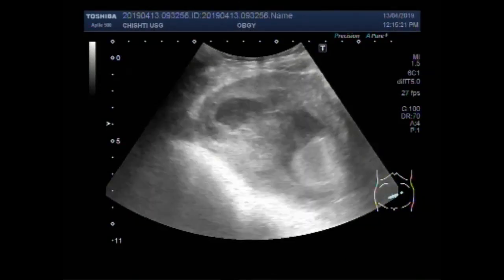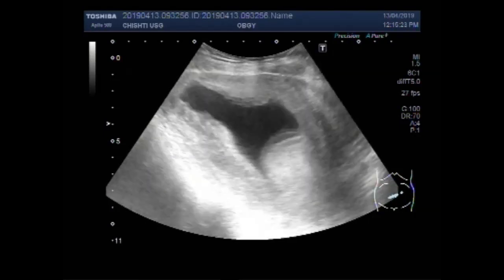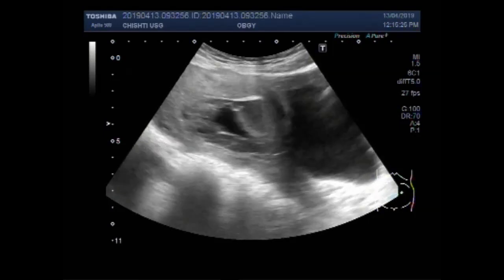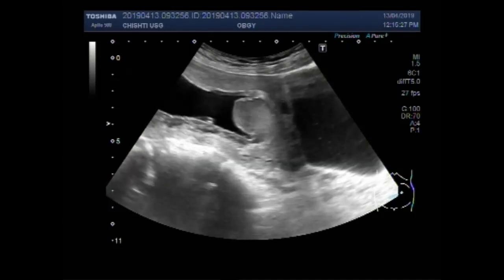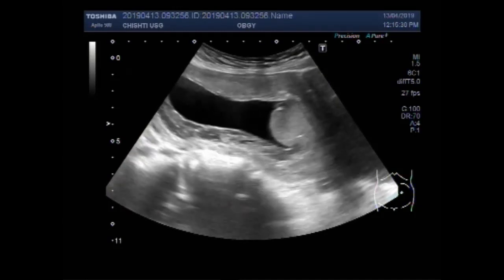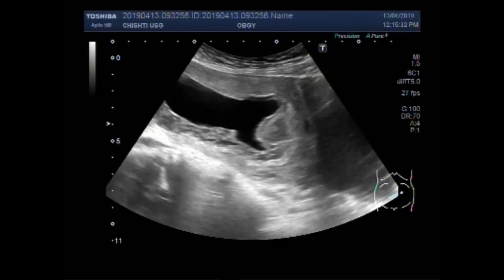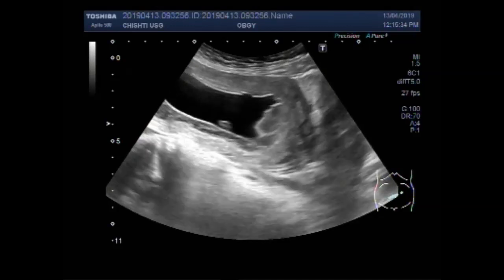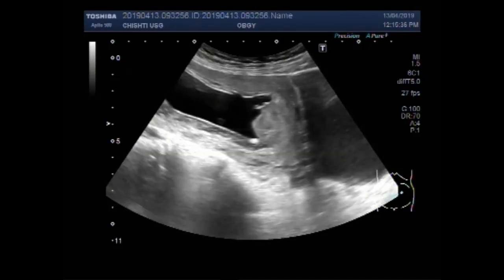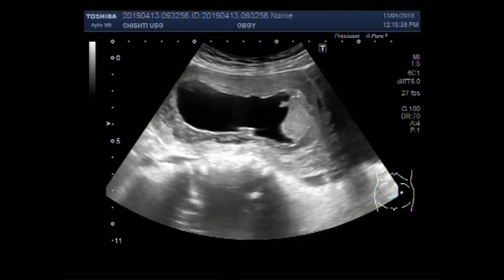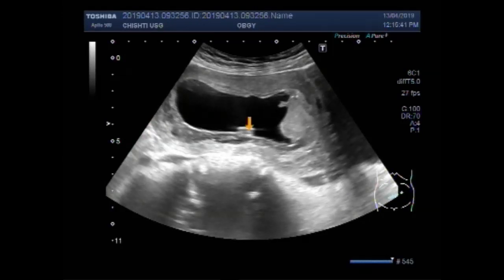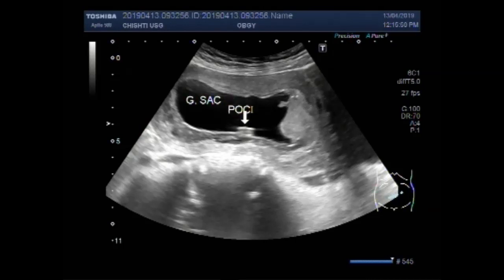This ultrasound video shows a case of blighted ovum. You can see the gestation sac without having any fetal pole. Only a small product of conception (POC) is visible.